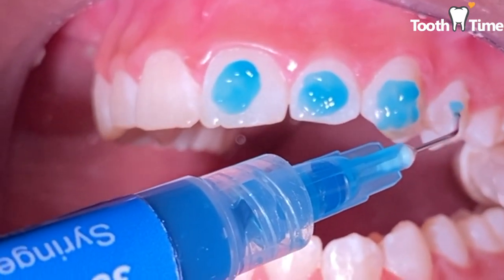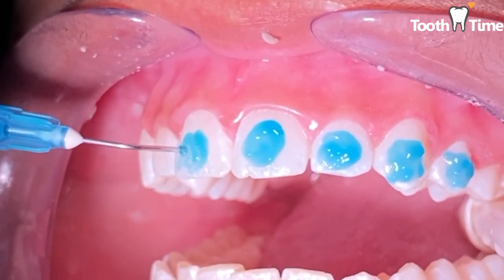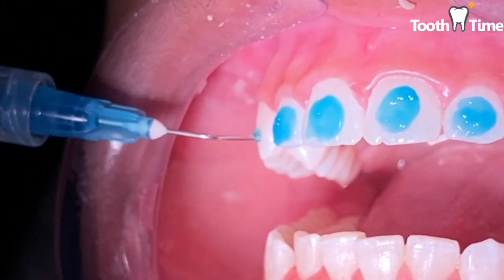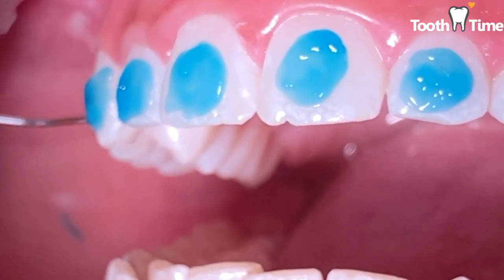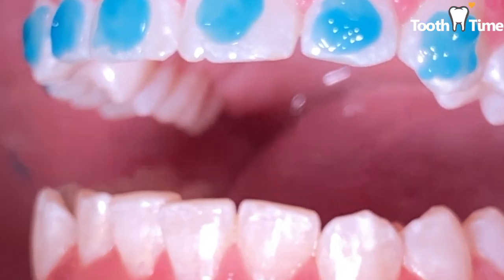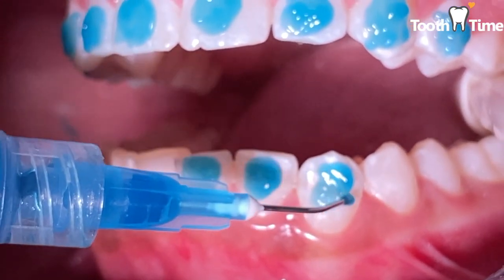What the blue etch does is it makes the tooth chalky, so when we blow air and apply the bracket it's gonna adhere a lot tougher and get good retention. When they put the blue shampoo on your teeth and wash it off, it does not taste good — it can taste really sour or tart. You just have to make sure you get your mouth rinse afterwards, stay open, and make sure that area stays really dry from there on out.